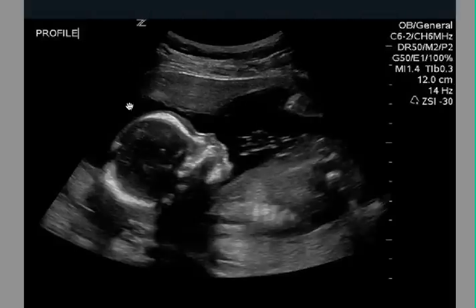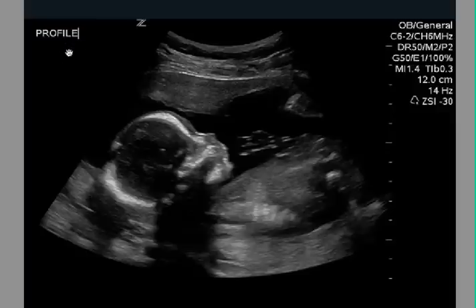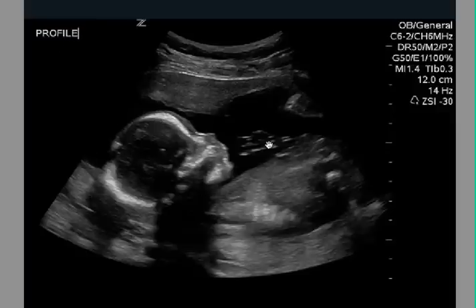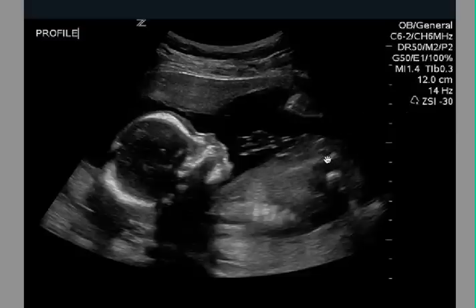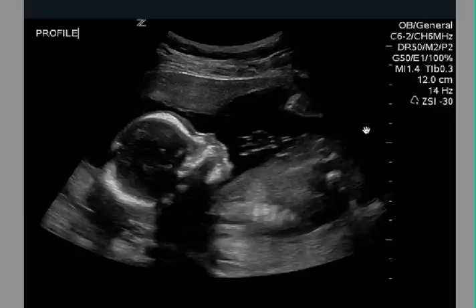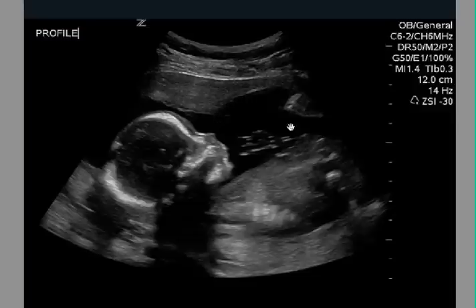In this example, the baby's head is pointing up because the dot is on the left side, which is pointing up. So this is a breech presentation. The birth canal is down here and the baby's feet are also down here. You definitely want to know if the baby is breech before delivery because it's much more difficult to deliver a breech baby. Again, this black area is amniotic fluid.